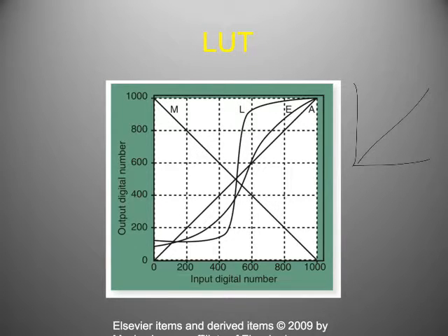This is a graph of what the computer sees, right? It just gets a straight set of numbers, right? This is what a discrete sample would look like.